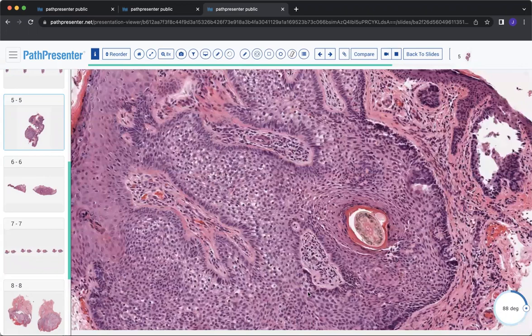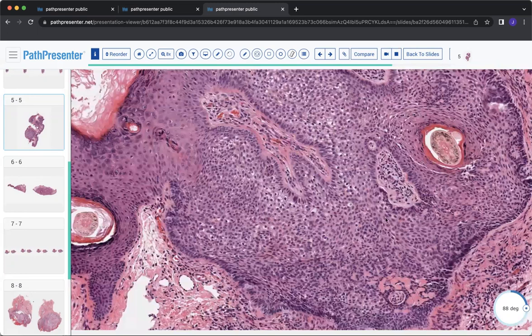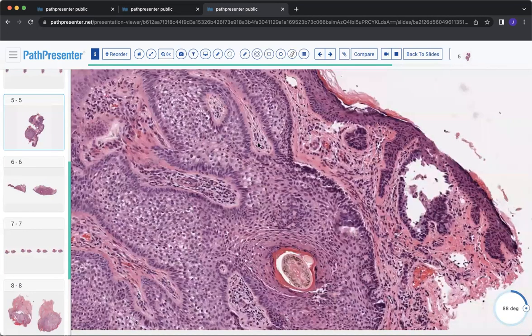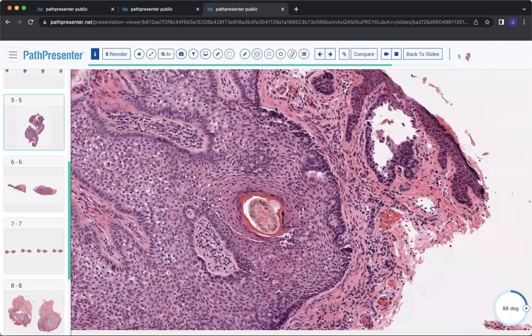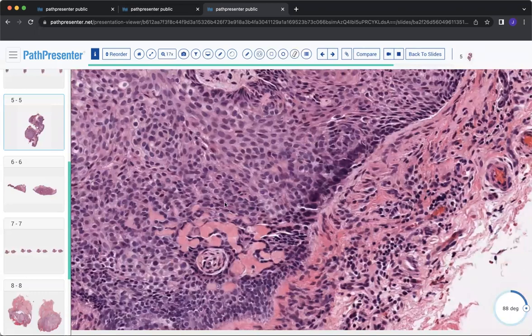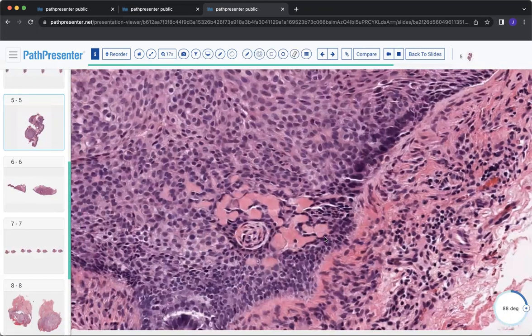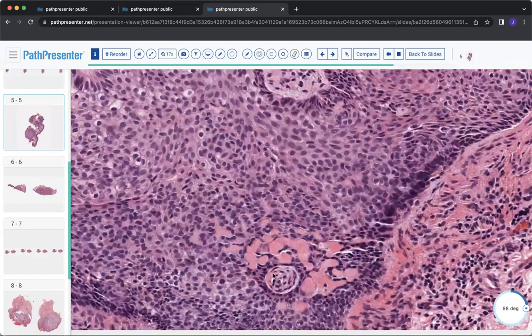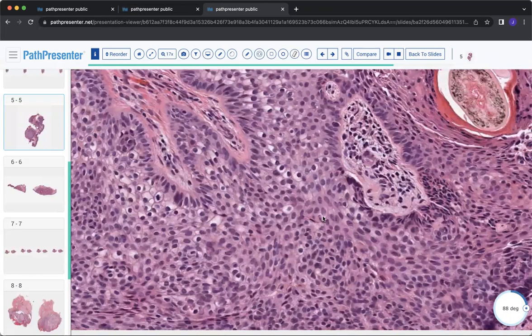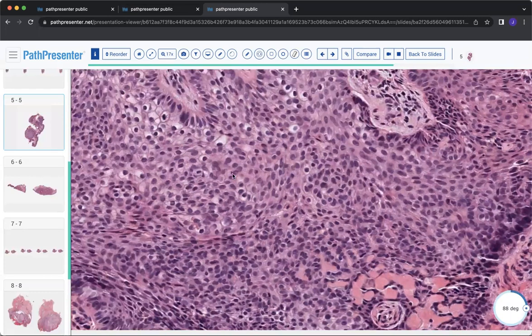Now, if you thought that this looked like a basal cell, don't be upset with yourself, because many people who don't have the trained eyes of a dermatopathologist may easily jump to and confuse it with the basal cell. You might see some retraction and that peripheral palisading. Definitely, you might be thinking it. There's some other areas in here, though, that are collecting this eosinophilic globule material, which is essentially that basement membrane-like material that's collecting out here on the edge. And if you've seen that and it made you think of a cylindroma or spiradenoma, that's because you can see those eosinophilic globules in those entities as well.